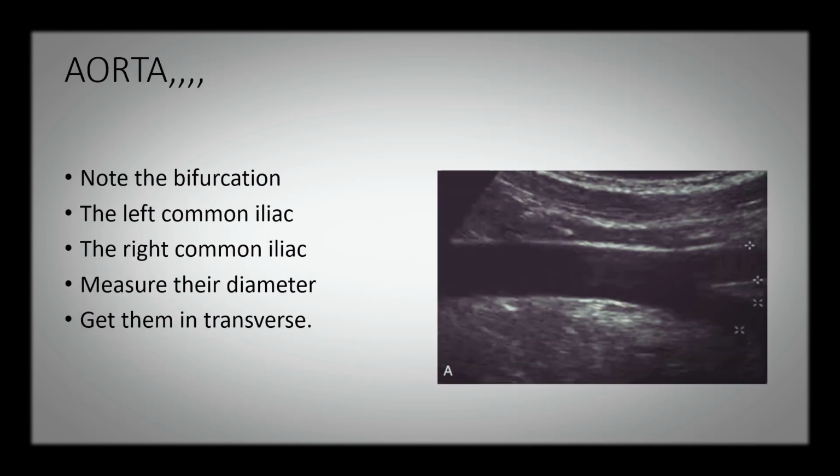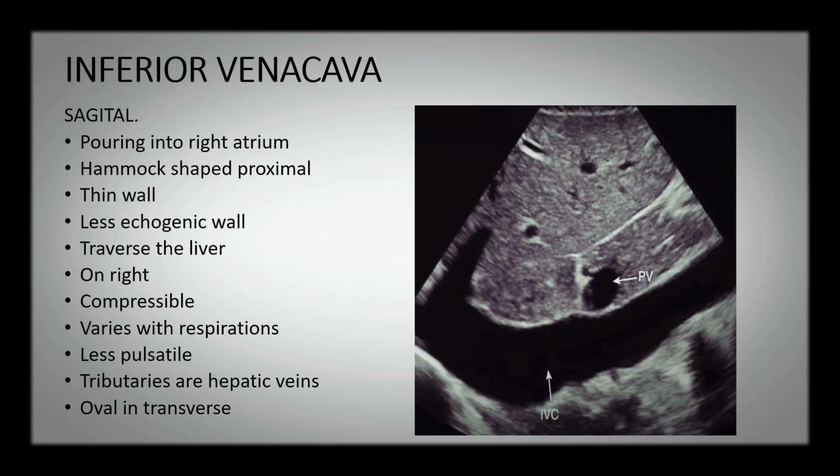Alright, with the aorta still, we can see the tubular structure reaching this level, then giving out these two branches. So this is the aorta bifurcating into the left and right common iliac arteries. Before bifurcating, the measurement is taken at this level, which shouldn't exceed 2.0 centimeters.